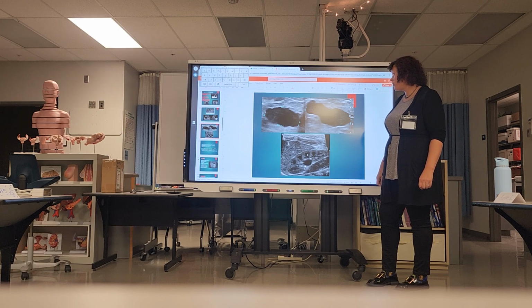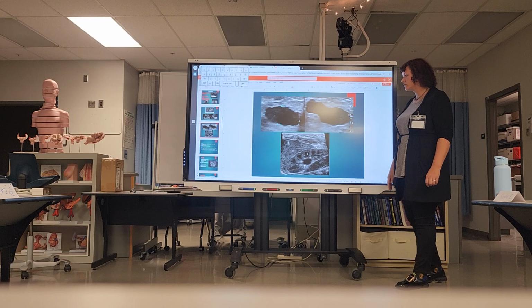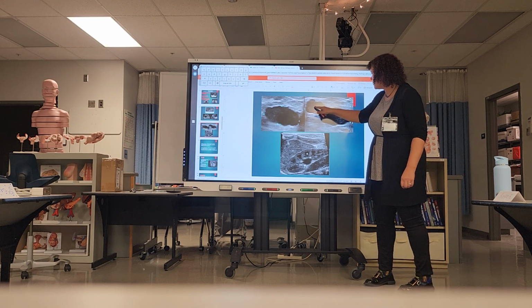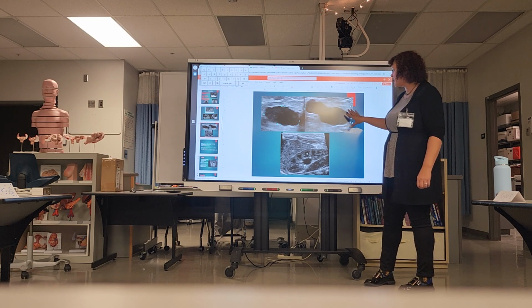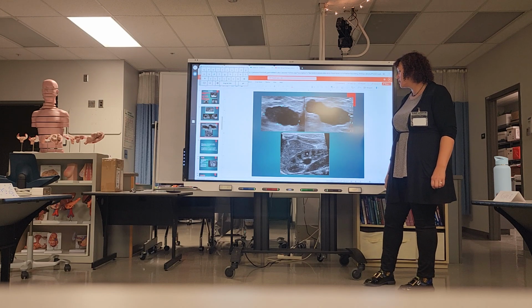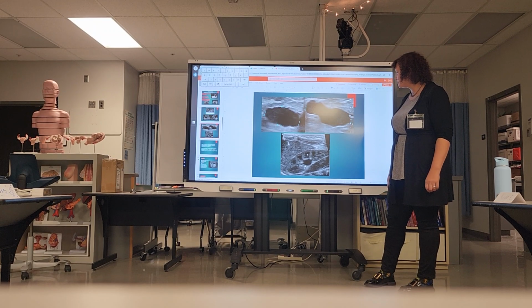So why is this not anechoic? Because there are some echoes. It looks heterogeneous, low level. Yeah, there's some little white speckles in there, but for the most part, this is hypoechoic. But how do I know that this is not fluid filled? You don't see any enhancement. There's no enhancement. Okay, good.